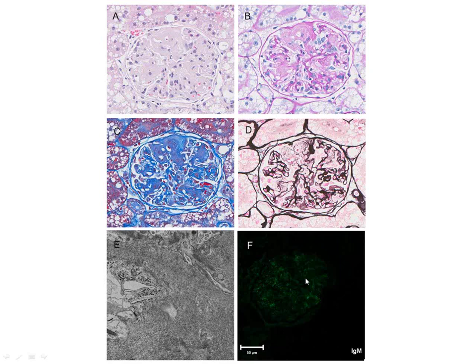And then with the IF, I've always called the amyloid deposits, often, especially with IgM, but also with the others, get what I call a blush kind of thing. It's sort of like the glowing cheeks of an embarrassed lady. It's not negative, but it's not this intense splotchy that we saw in the segmental sclerosis, but it sort of just blushes, and that's a common observation in the immunostaining of amyloid cases. For dogs and cats, yeah.